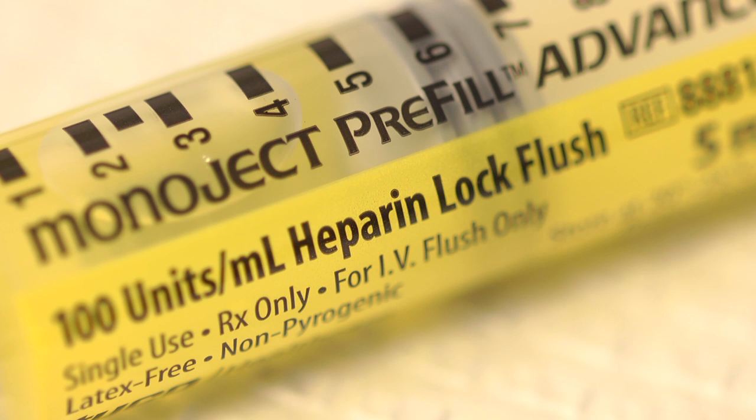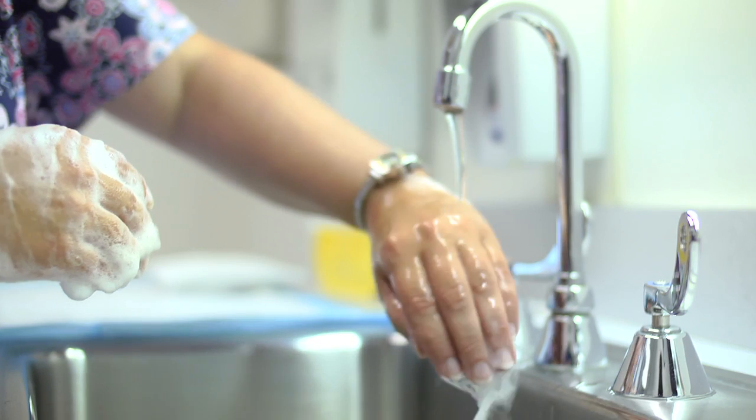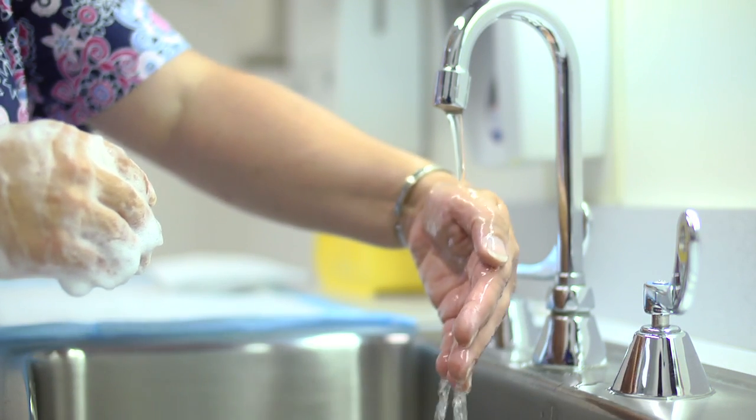Flushing a central line requires saline flushes and alcohol pads. Depending on the line, the doctor may want your line to get heparin, an anticoagulant, to prevent the line from clotting off. Before anyone does anything to a central line, they need to wash their hands. Good hand hygiene is one of the most important ways to prevent infection.